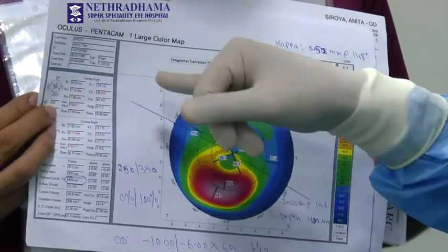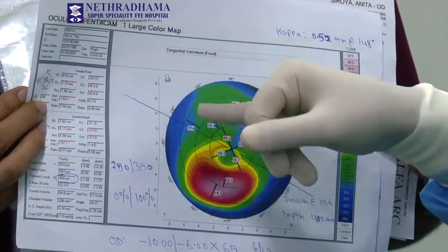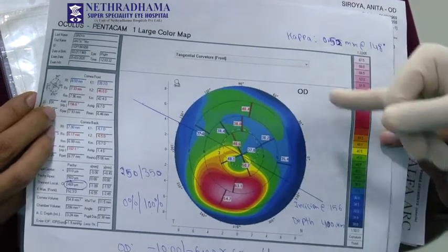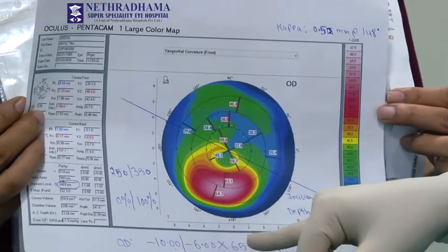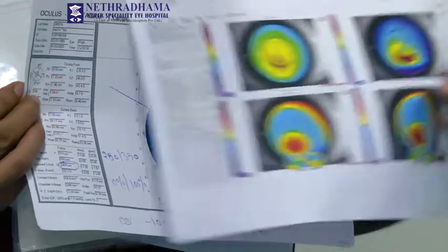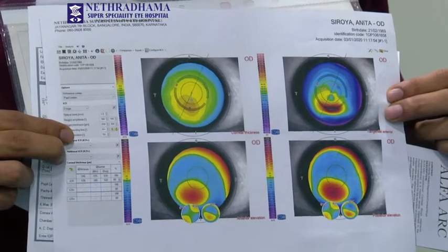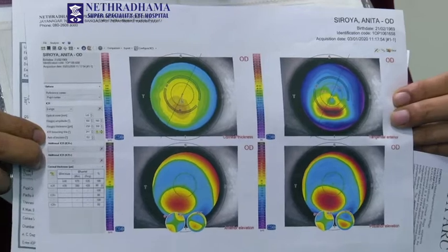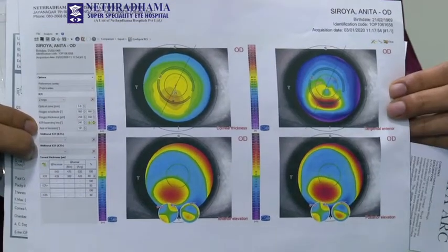You can see that the axis is at 156 degrees. That's where the incision is going to be. The 350 micron ring is going to come inferiorly and the 250 micron ring superiorly. The refractive error is minus 10 with minus 6 cylinder improving to 6/12. The aim is to improve the surface of the cornea, improve the regularity, and then later correct the residual refractive error with the toric ICL. This is the map from the MS39 which allows you to plan rings and the placement of the ring.